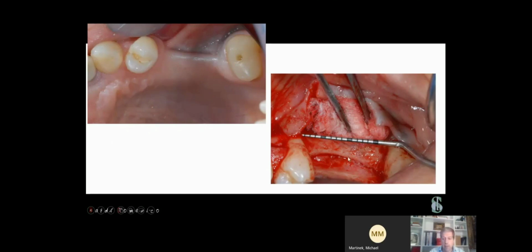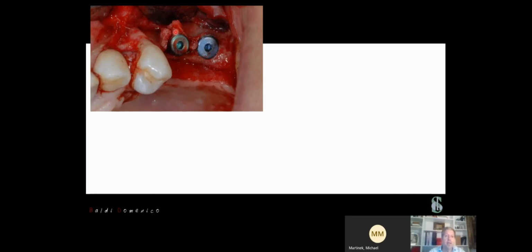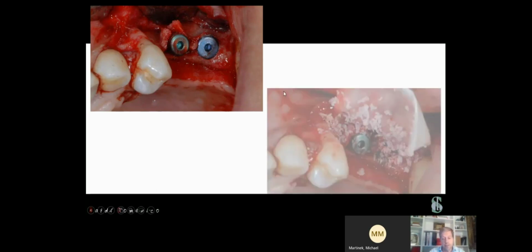You can see how thin the bone is. You can see that here it's impossible to think of placing an implant directly. So it's necessary to prepare our implant site in an atraumatic way, but at the same time it's necessary to obtain a good expansion of the bone. And here we decided to make this kind of approach with osteotomes, and we obtained this expansion of the bone in a perfect way. We controlled this expansion, and it was possible to place an implant of 3.8 millimeters of diameter. This damage is not a problem. It's enough to place a heterologous bone filler and a collagen membrane, and we can have a good healing.